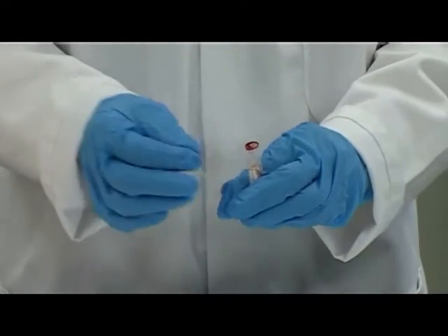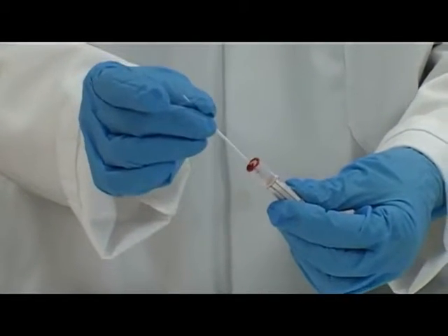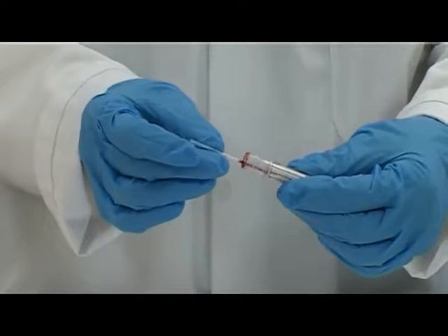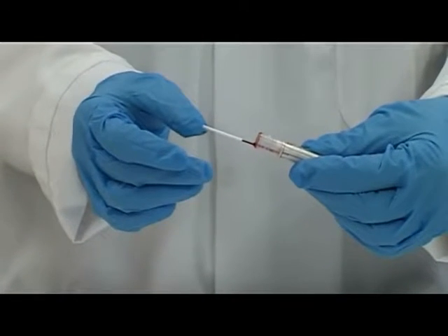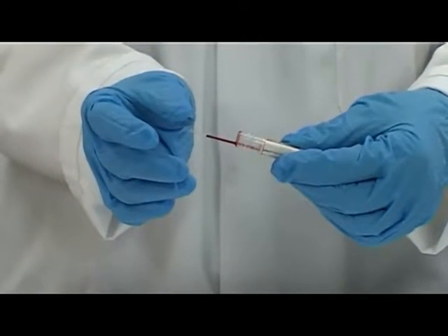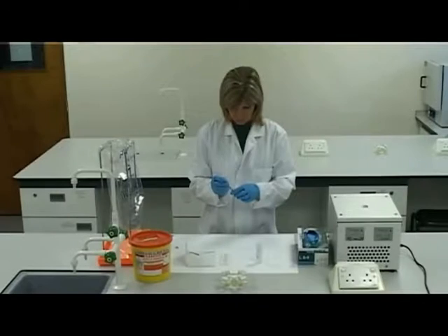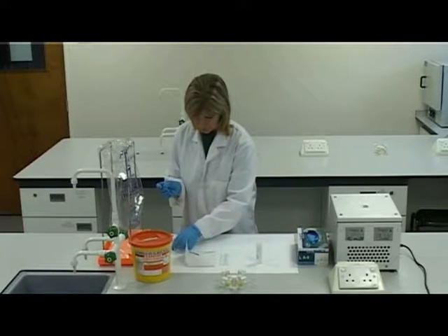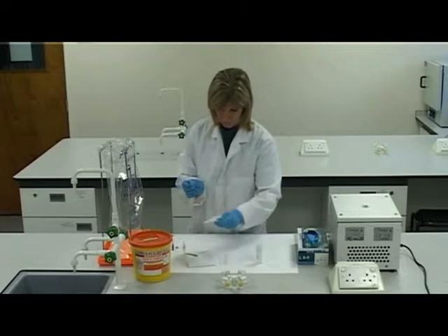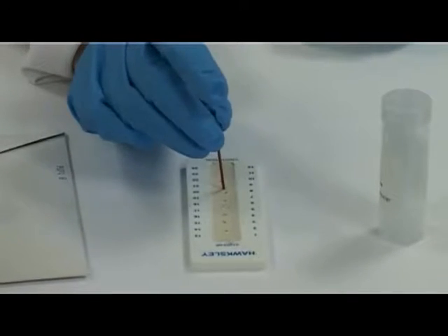Insert the capillary tube into the sample, holding the EDTA tube at an angle. Fill the capillary tube to at least three quarters full. Place a finger over the top end of the tube or keep the tube horizontal. Remove the capillary tube from the sample and wipe the outside with tissue. Plug the end of the capillary tube with a soft clay sealant.